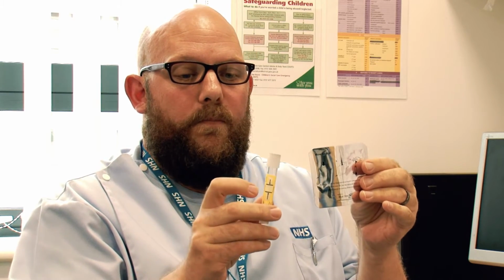So the tests themselves. If you order a urine test, which men have to have, while women get to choose whether you have a vaginal swab or a urine test, you will have this bottle. It will also come with this silver foil package. This opens and it's freestanding. So you just open it, then you urinate into this, and then you pour it into the bottle, but you need to get the urine between these lines, so in this box. It can't be under, can't be over. So that's the urine. Lid on tight.